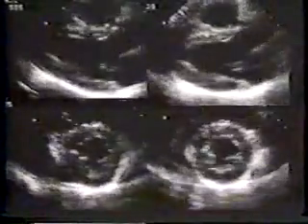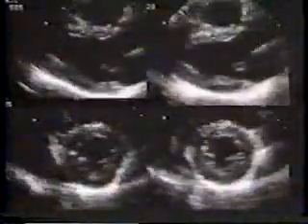This 64-year-old male was experiencing intermittent chest pain and was referred for exercise echocardiography. Here, his parasternal long axis and short axis resting images are displayed on the left, and the corresponding post-exercise images are displayed on the right. The frame grabber allows the examiner to capture and compare optimum cardiac cycles. This is particularly valuable for the post-exercise study, where pronounced respiration may completely obscure images from all but a few cycles.